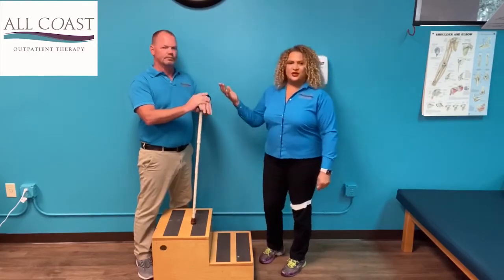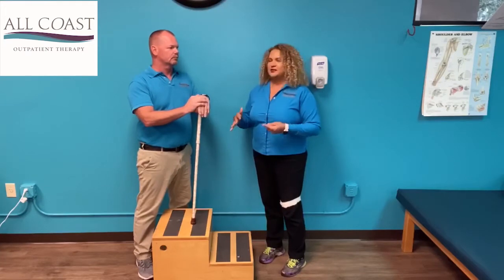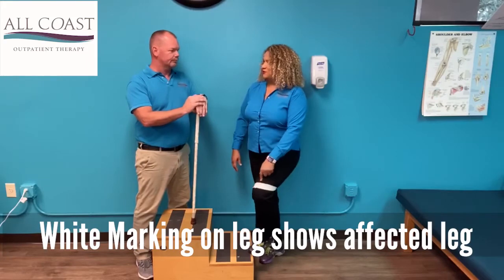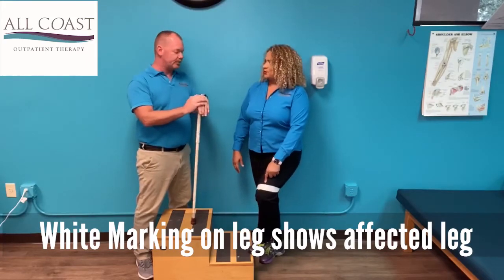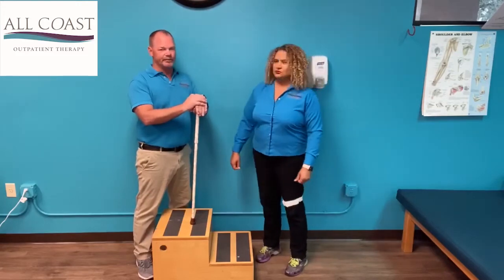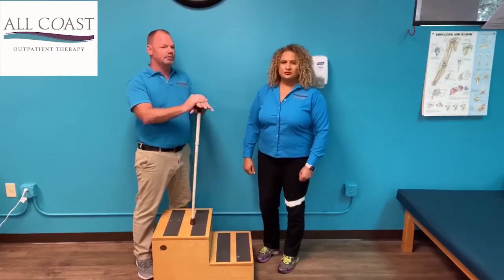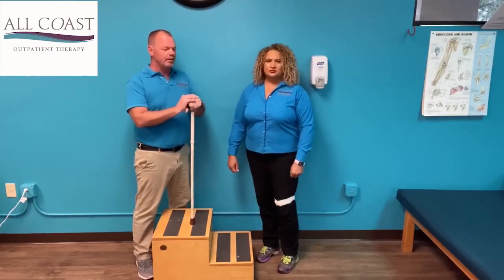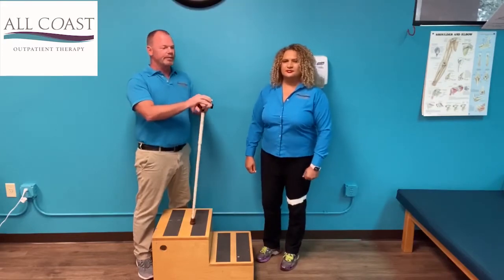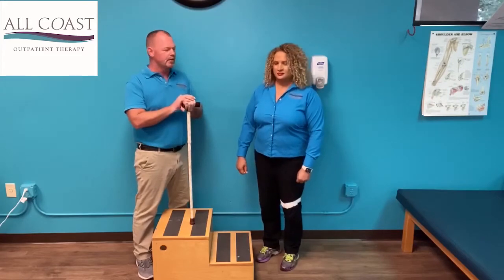Michael is going to instruct me on how to go up the stairs and how to go down the stairs. We've put the marking on my leg to show my affected leg. Many times in life, you come up with something that causes you to have one leg weaker than the other, and you need the cane for balance and support. We went over how to walk on level surfaces, but sometimes you come up to curbs and sometimes you have to go up steps and stairs.